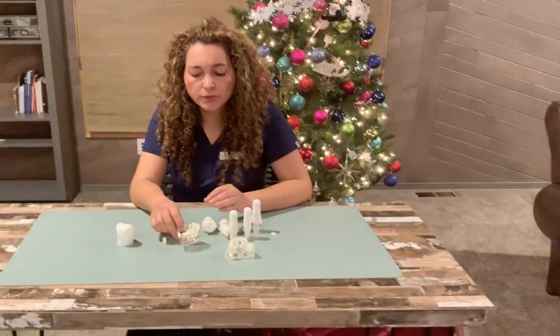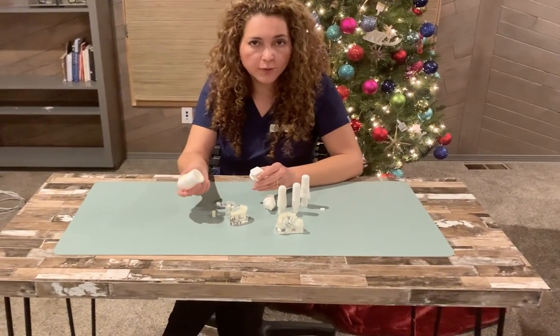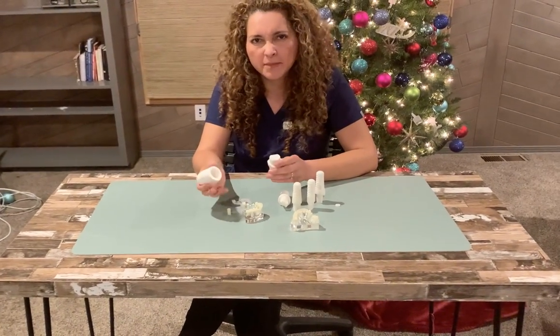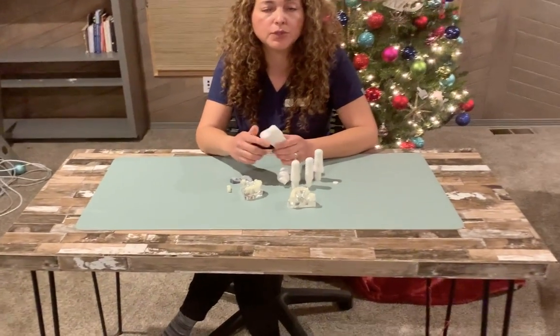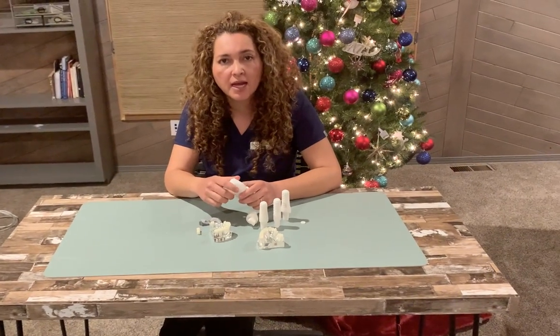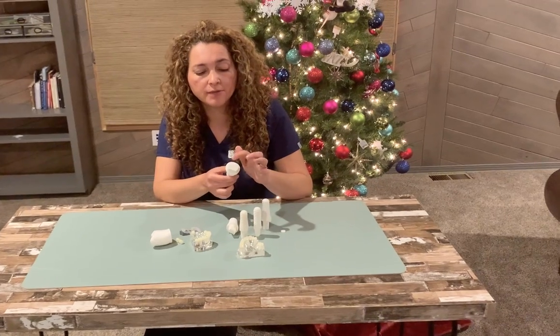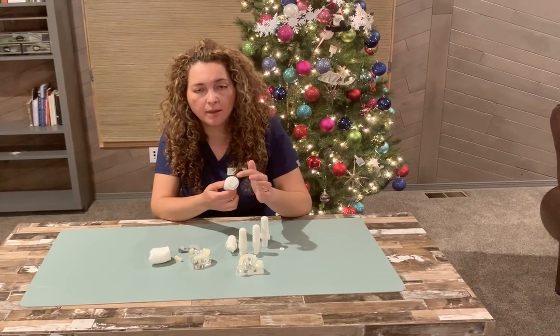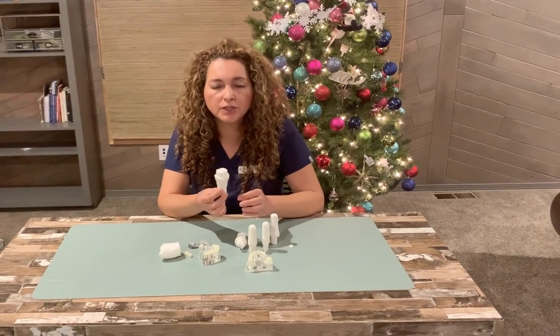We're going to do a crown with our CEREC machine in the office. It takes approximately 45 minutes to one hour, depending. If we need to do a gingivectomy, we're going to use the laser, or sometimes we place a retractor cord. A lot of times, because the design of Seren root is great — it's like a prep already done for us — sometimes we don't even have to touch the implant.